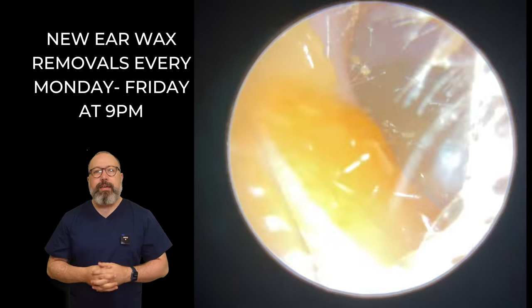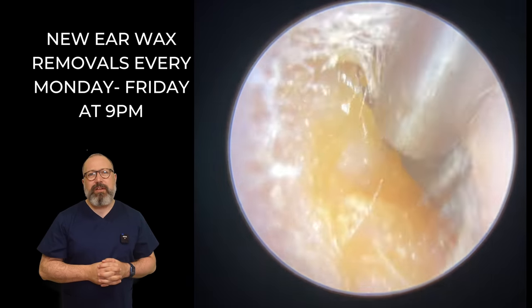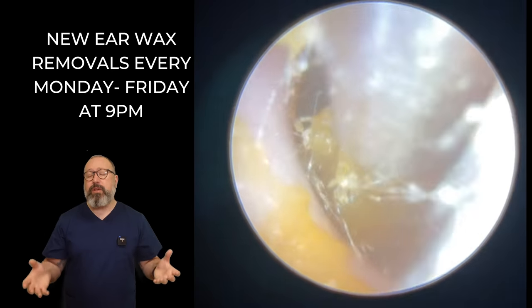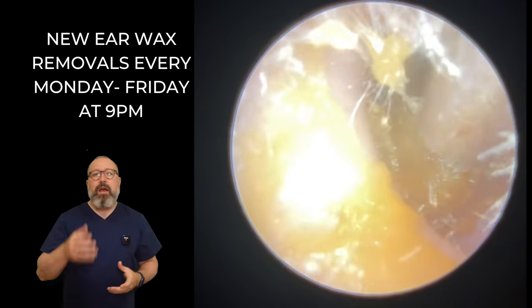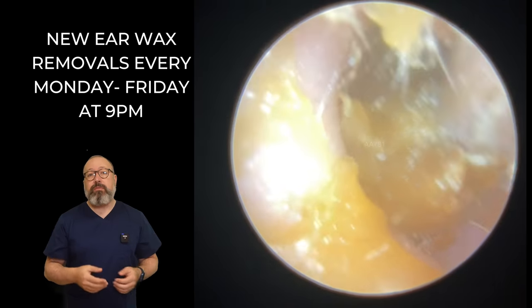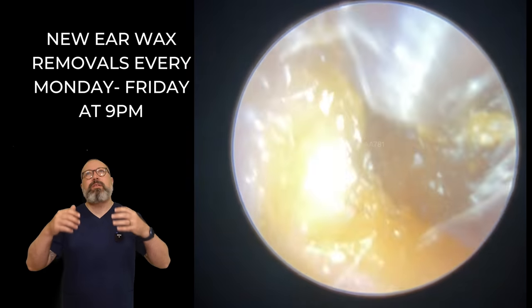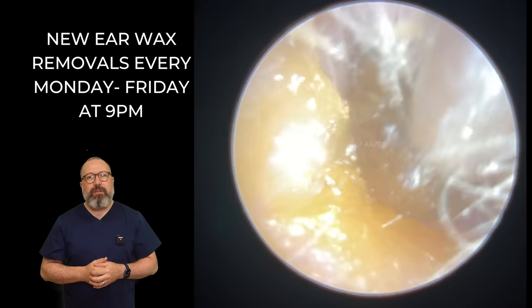So patience on this ear here. You can see a much flatter piece of wax. It does look like there's a little bit of a gap just above. Now, patients don't always realise they have wax problems — they don't always realise they're waxing the ears unless it's blocking you up, or you can feel it, or it's causing some discomfort, intermittent hearing, those kind of things. A lot of the time we'll be walking around with wax in the ears and we don't even know we've got it in there. So when this patient came through, they came to have their one side done. I took a look at the other side, explained there's some wax in there, and they asked if we could remove that at the same time.